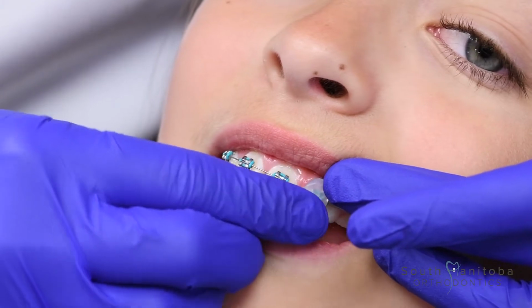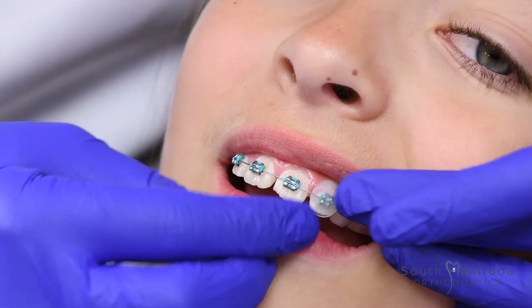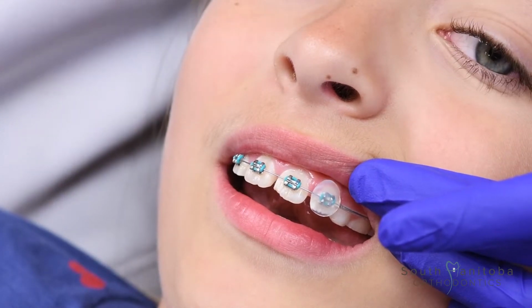Just remember to take the wax out before you eat or brush your teeth. But if you don't and you accidentally swallow some, don't worry about it. It's not harmful to you.